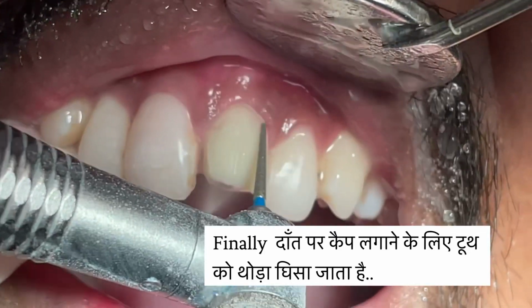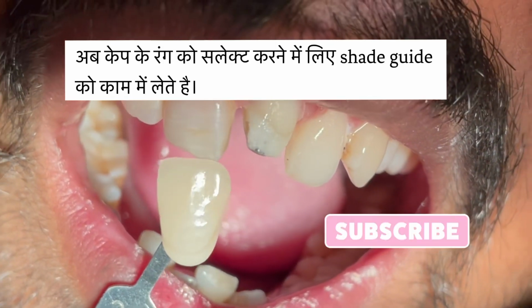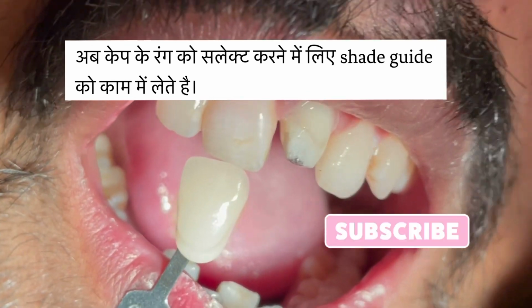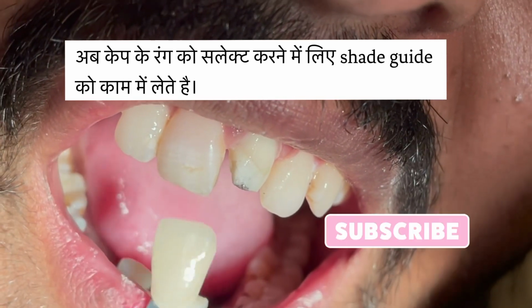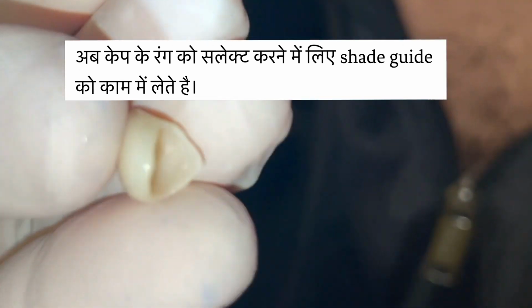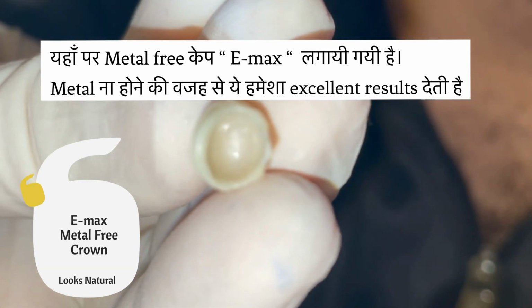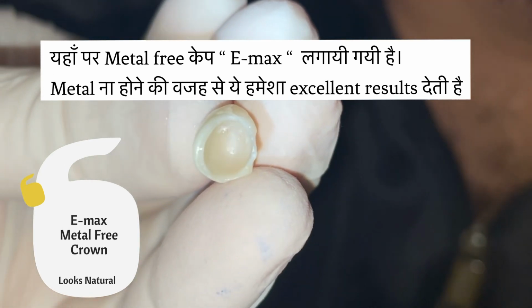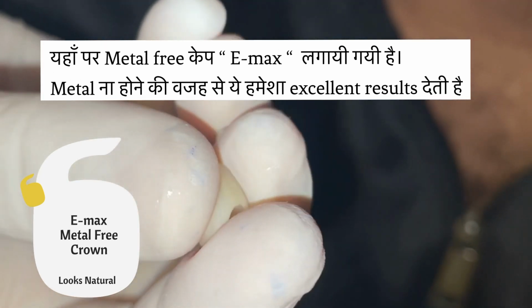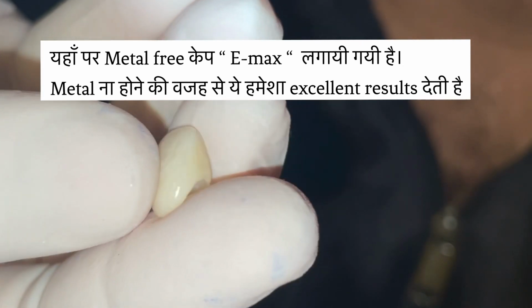The tooth is shaped from all directions. Then we proceed with the next step called shade selection. We select the color, shape and size of the crown according to the adjacent teeth so that it looks more natural in appearance. So finally we have got the crown. This crown is an Emax metal-free dental crown, and it looks more natural in appearance than other varieties of crown, and it's more suitable for the anterior teeth.